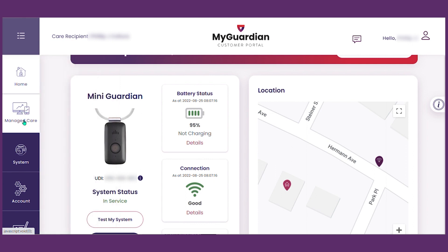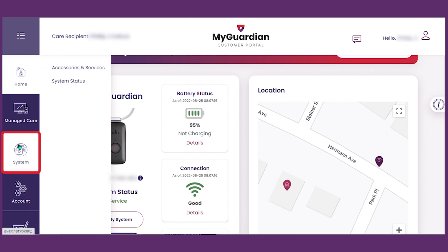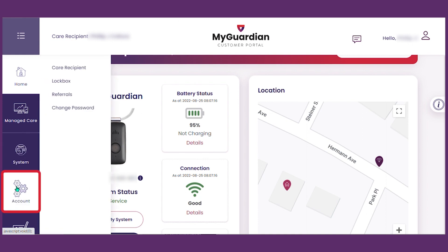This is the System button. Here you can view accessories and service and the system status. Here is the Account button. On this page, you can update care and recipient details, lockbox information, submit a referral, or change your account password.